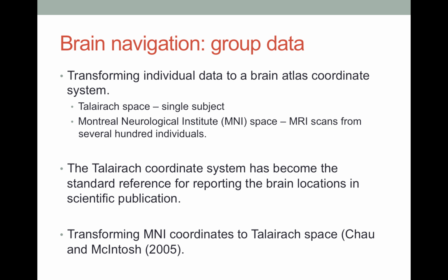When we look at an individual brain, we can see the anatomical landmarks. This requires manual identification of our region of interest in each individual brain. For instance, when we want to locate Broca's area, or the pars opercularis and pars triangularis making up Broca's area, we can do this based on the sulci and gyri in the brain. But this is very costly in terms of time, and sometimes regions of interest may cross functional boundaries.